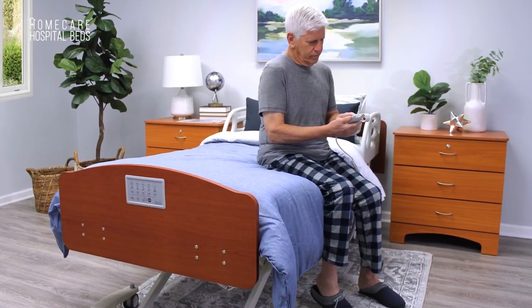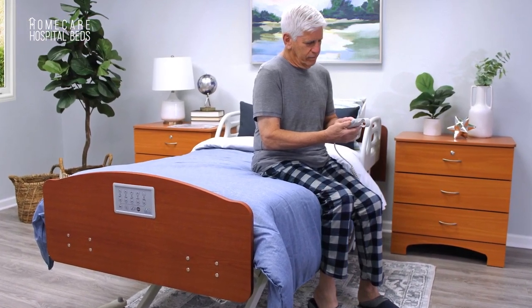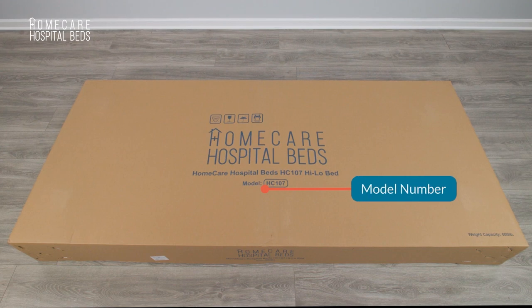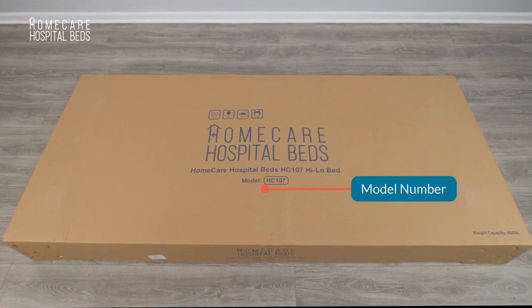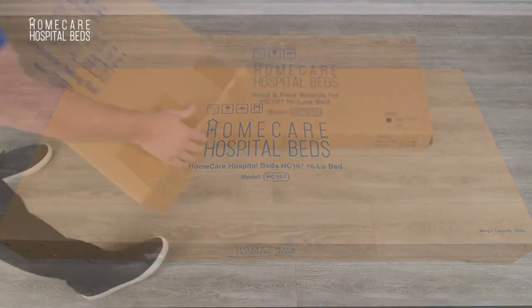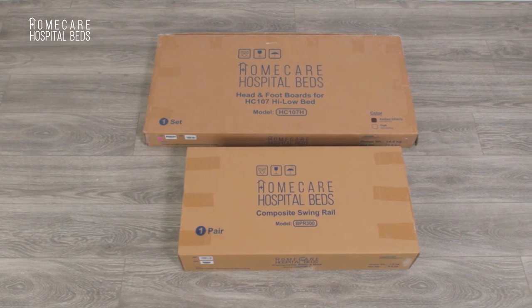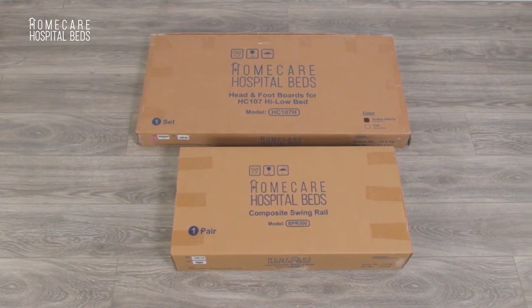This video is for instructional purposes only and does not replace the use of the owner's manual. First, please verify that you have received the correct bed model and inspect the shipping carton for any potential damage. If damage is found, stop the assembly process and contact HC-107 for further instructions.